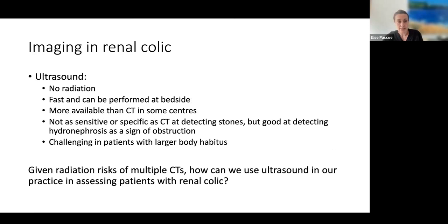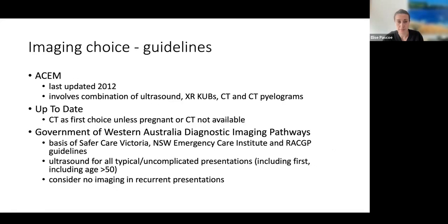Ultrasound has no radiation, is fast, and can be performed at the bedside. It's actually more available than CT in some centres, probably not in a centre like ours. It's not as sensitive or specific as CT at detecting stones, but it's quite good at detecting hydronephrosis as a sign of obstruction. But we know it's probably challenging in patients with larger body habitus.